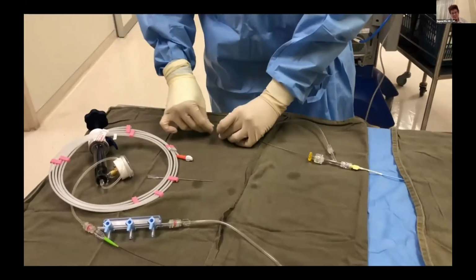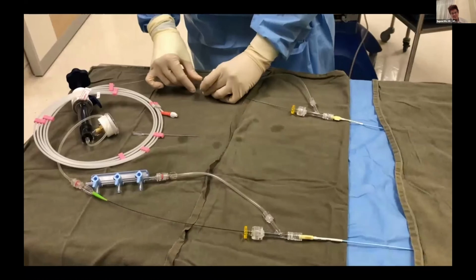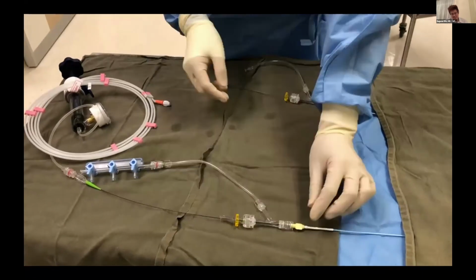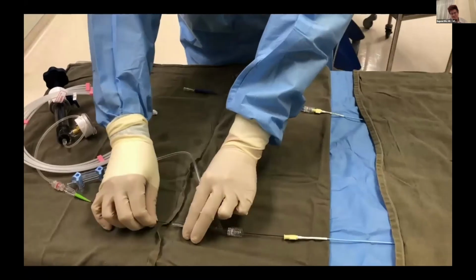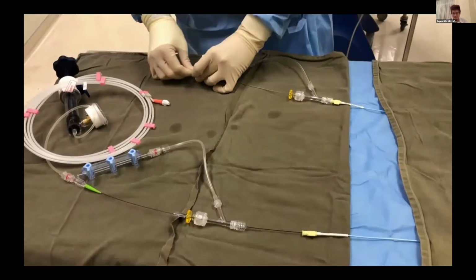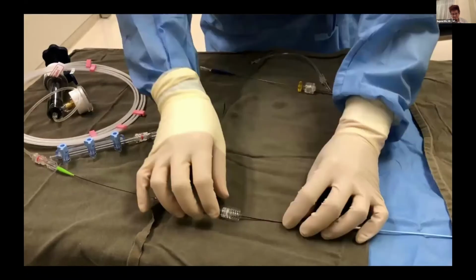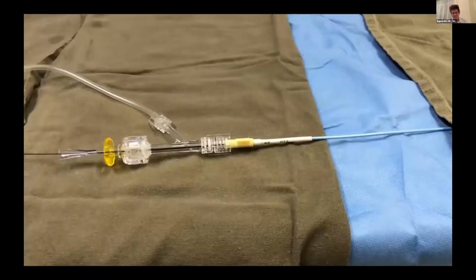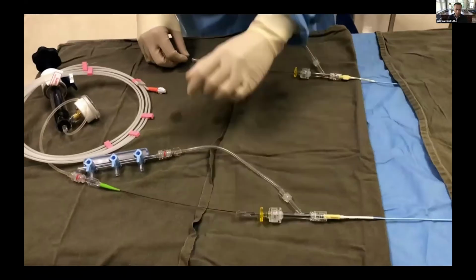When we can see that it almost reaches the antegrade guiding, we will put the wire introducer in parallel to the anchor balloon. At this point, we can loosen the hub and undo the Y connector, and then back the Y connector off the balloon. We keep pushing the retrograde RG3 wire until we see it come out of the antegrade hub, like that. And then we get hold of the wire tip and we place it inside the wire introducer. And we connect the wire connector. We push the retrograde wire more so that it now comes out of the hub, like so. And then we remove the wire introducer.